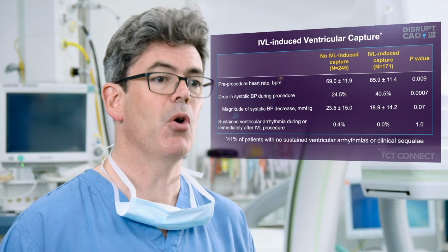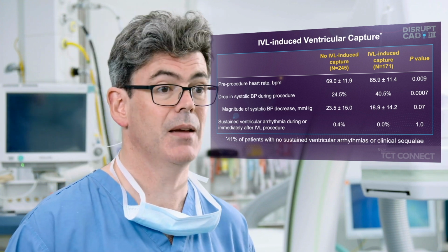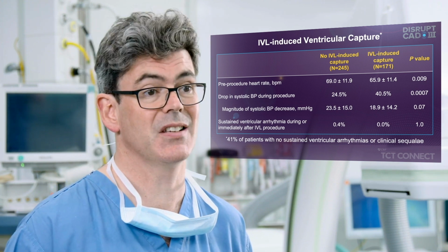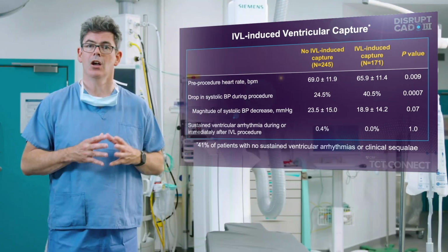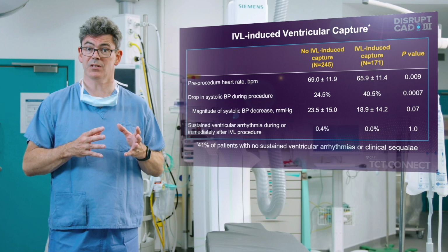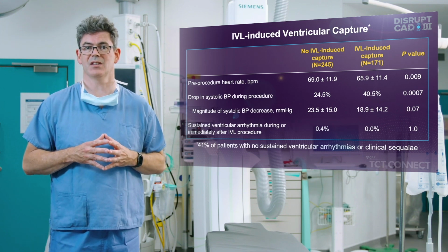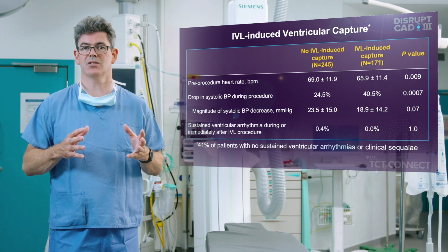It was significantly more common if the pre-procedure heart rate was lower, particularly by multivariate analysis less than 60 beats per minute. The drop in systolic blood pressure was more frequent, but as you can see, not more severe based on this analysis, and there were no significant sequelae.